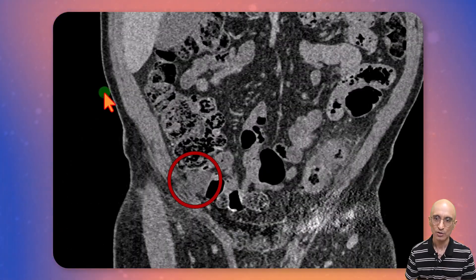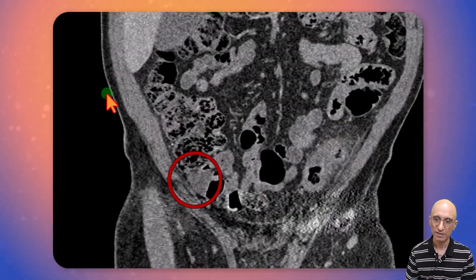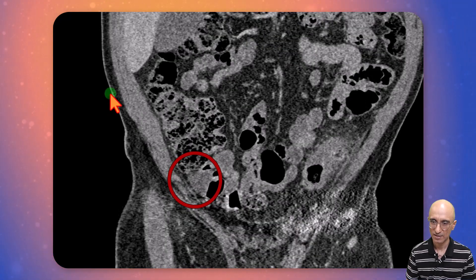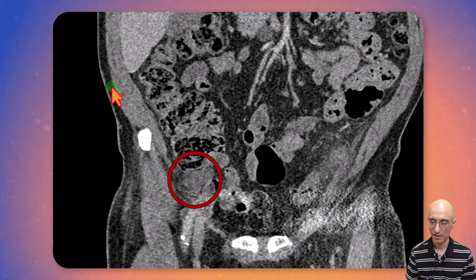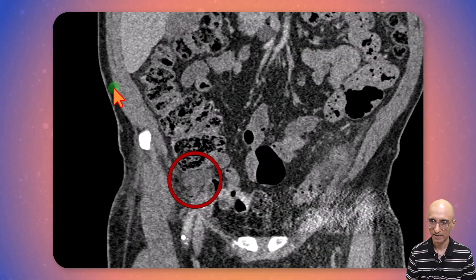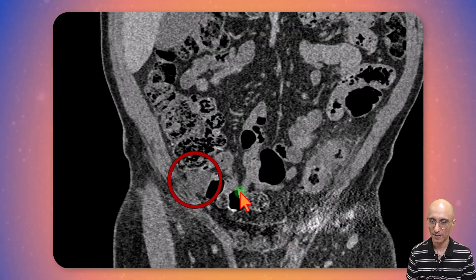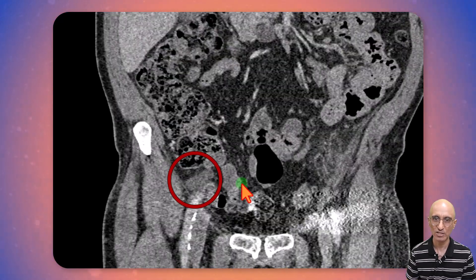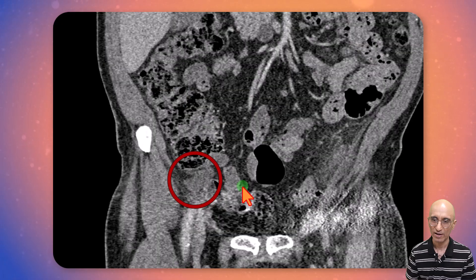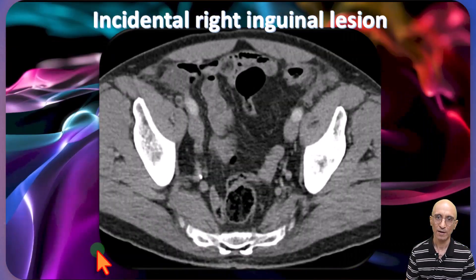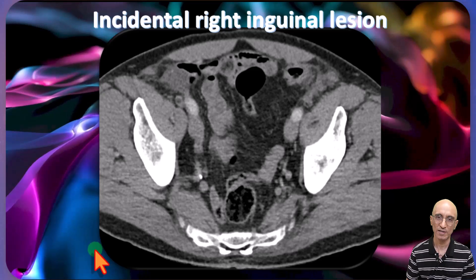I'm going to show you the coronal images. Again we see that lesion described by the radiologist, but if we take a closer look, it has a conical shape in the region of the right inguinal canal. Appearances are consistent with a hernia mesh plug.